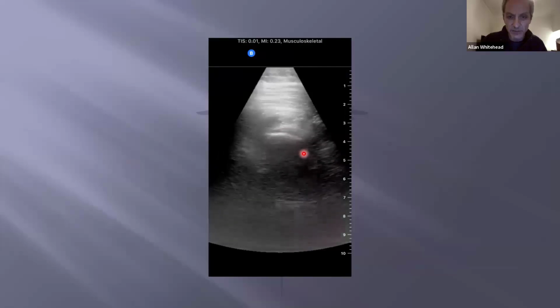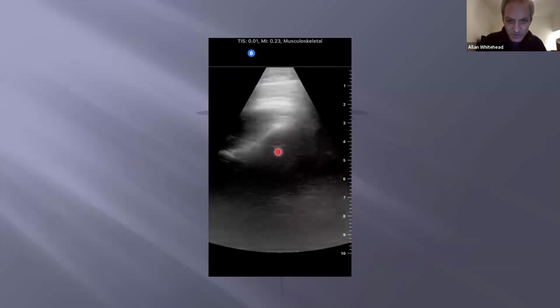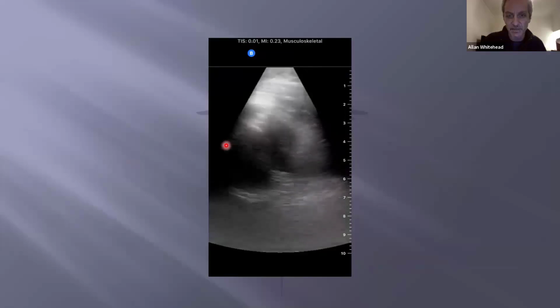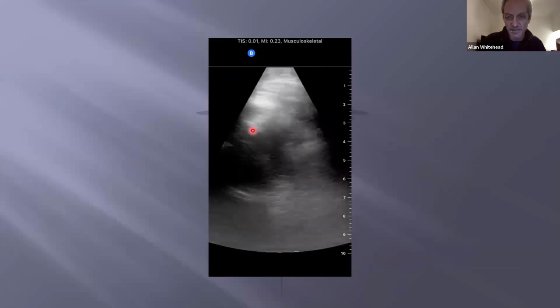And just working on trying to optimize my position. There it is. So there's that flat C or S, had to be pretty quick there, but there it is. I could freeze the image. So the glenoid is here, and the head was, again, not a great image, but the head was sort of sitting down here. There's the glenoid back up there, and the head sort of down here.